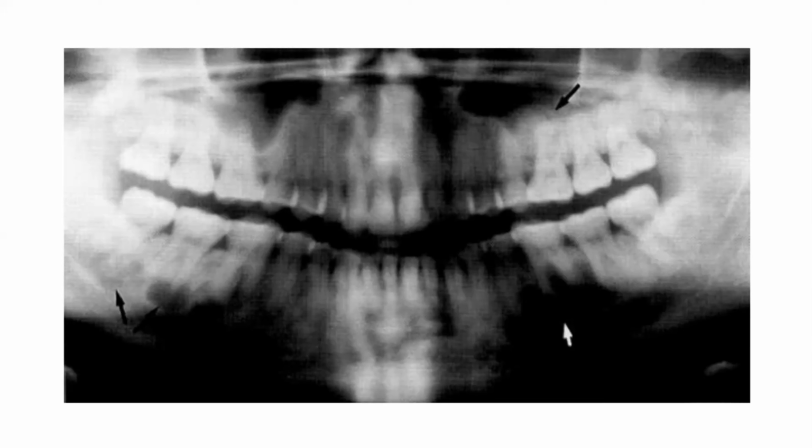The effects characteristic of this cemento-osseous dysplasia are that, again, they do not displace nor resorb adjacent teeth, which remain vital. Occasionally, it may cause expansion or enlargement of the affected jaw, and it can be associated with low-grade sclerosing osteomyelitis.